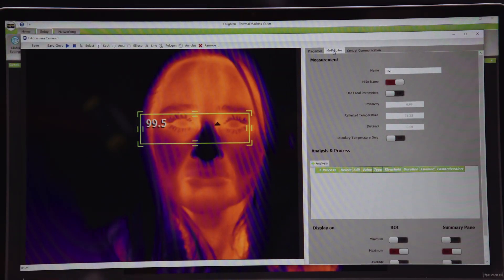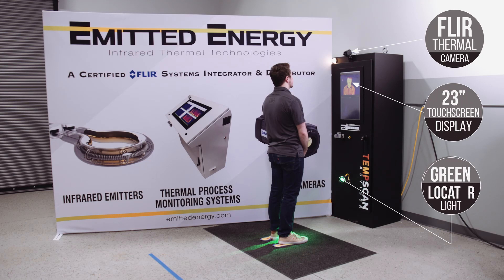The system quickly scans the subject in just under one second. If the temperature is below the set alarm, then the operator is free to move on. We measure 30 individuals at our facility with each package to establish that camera's specific temperature average. If the temperature threshold is met, an audible alarm can be heard alerting the subject that they are above the threshold.